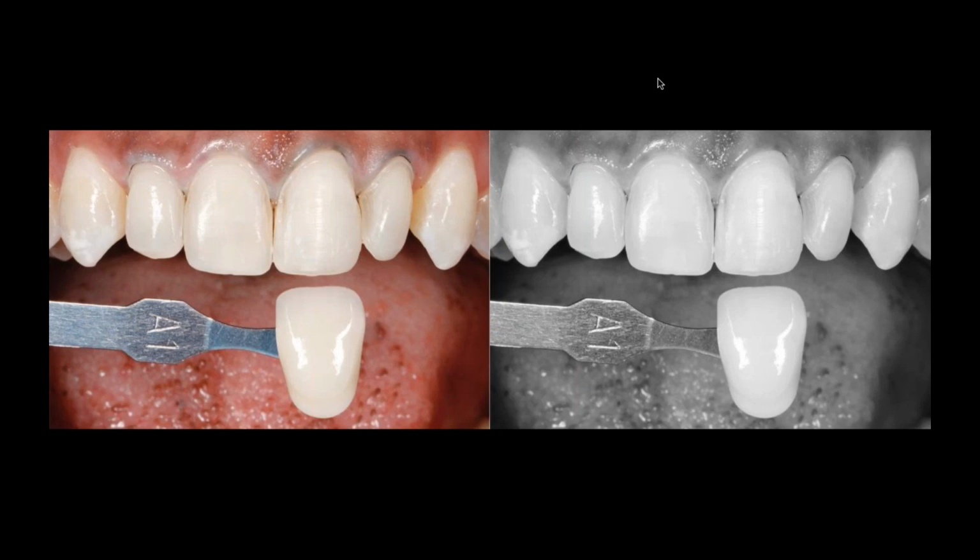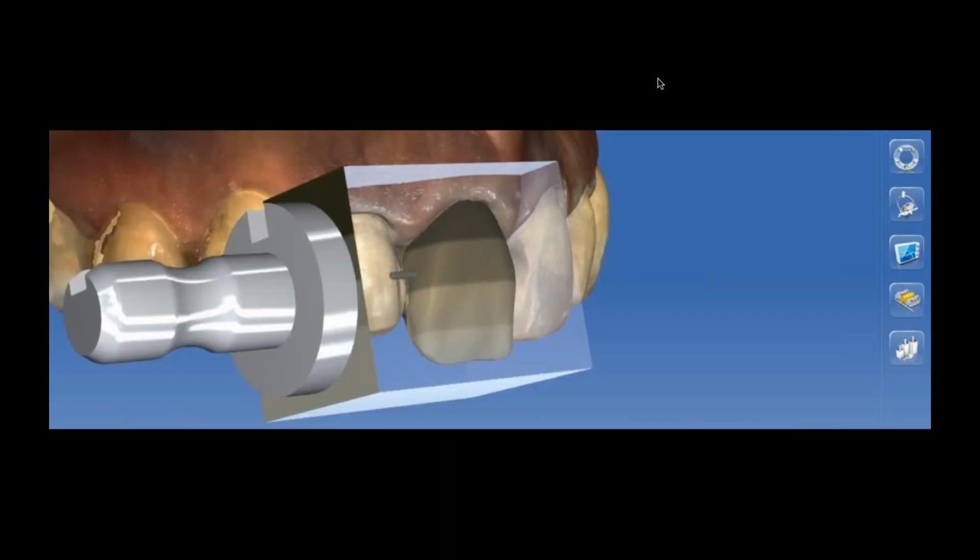I evaluate the color of the abutment and do my shade selection before I start the appointment, but I also do a second session of shade selection once I finish the preps. Here I want to make sure that the value, the grayscale, how bright or how dark the material is that I'm selecting, is something I'm going to be able to reproduce.